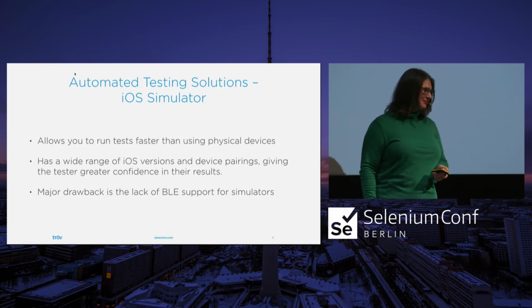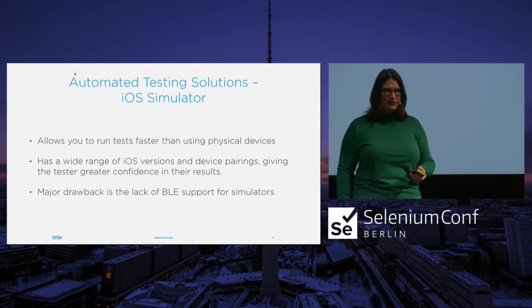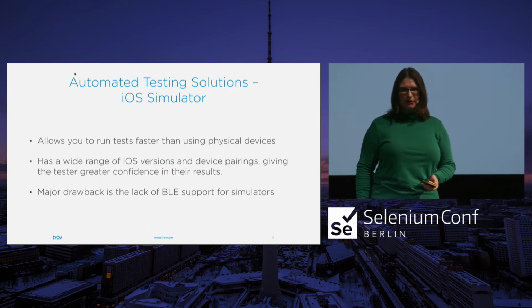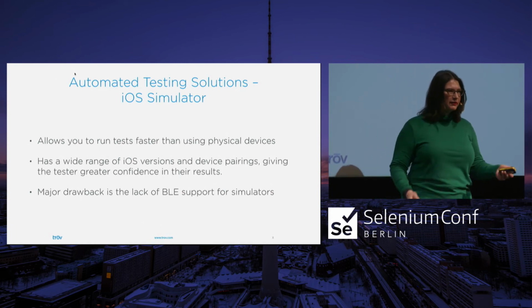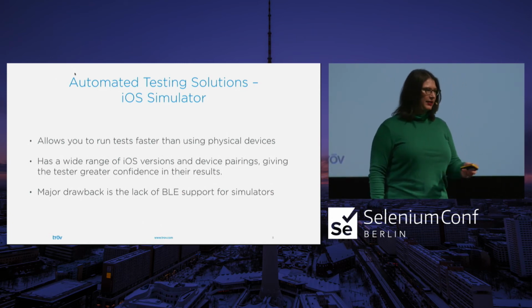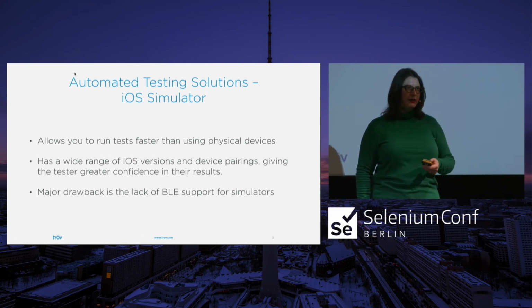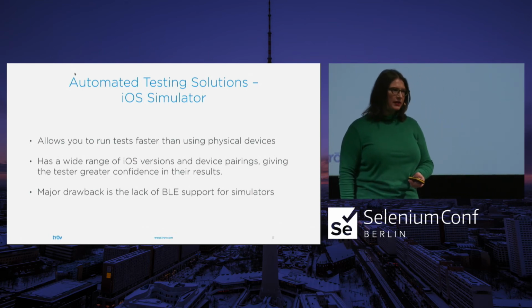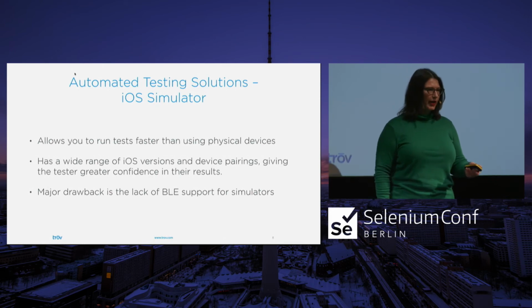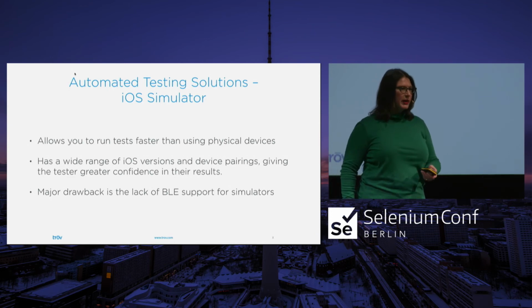It was terrible. Like I said before, BLE support. Most of your IoT medical devices use BLE in some fashion. The insulin pumps that people wear are Bluetooth connected to their phones. The nasal stimulation device we were working with, Bluetooth connected. Everything in the medical device world that's interacting with an app is typically Bluetooth connected. And typically you can only do a small amount of stuff in these apps without connections to the devices. If you want up-to-date information as to what's going on with your device, or how often you're treating, or what your insulin levels are, you need to be connected to that.